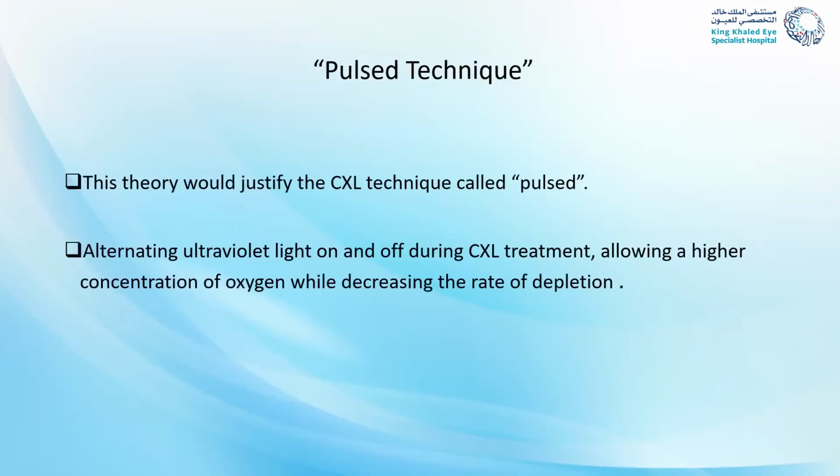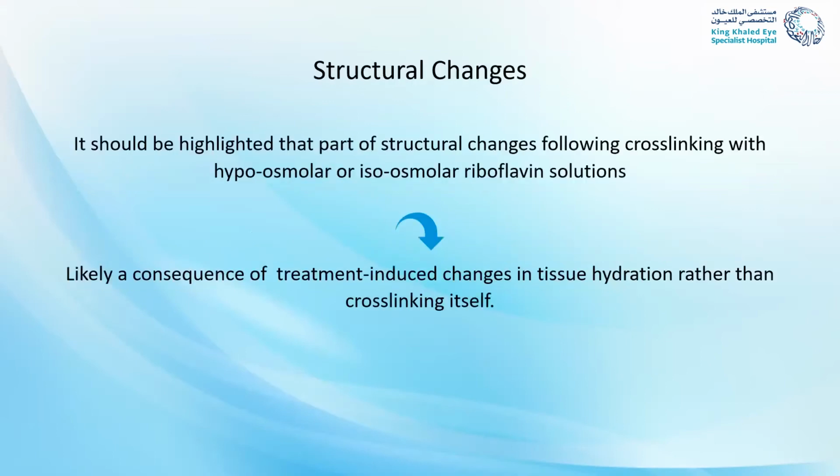And from here, the concept, as I mentioned before, the pulse technique is just to allow the replenishment of oxygen when you put the UV light off, and then you'll have a few seconds on and then off and then on, just to allow that good concentration of oxygen to get the best possible outcome of these covalent bond formations. So this is the reaction itself.